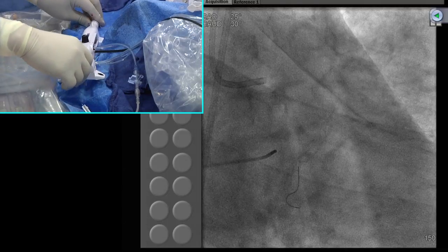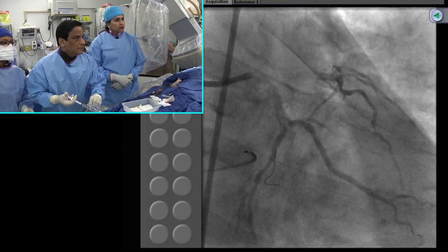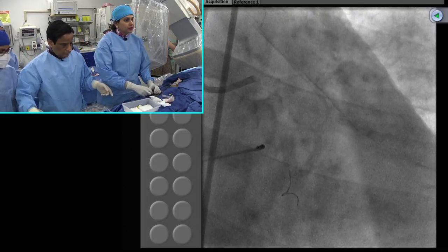No, even then, I think in this particular case, in an emergency setting, a balloon pump is better: a smaller access sheath and lower cost. Yes, that's it. And faster. No matter what, it's faster.